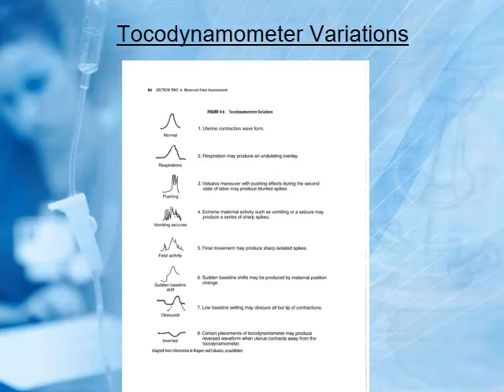These are some interesting things just to look at. This is a normal, nice curve. Respirations, you see the jaggedy, that's mama breathing. Pushing, you'll see it looks like the city of New York. Push, push, push, push. This is vomiting or seizures, but vomiting, you'll see that quite frequently. Baby kicking. So those are just some interesting things to see, to notice, because you'll see these a lot, especially when we're sitting out at the nurse's station.